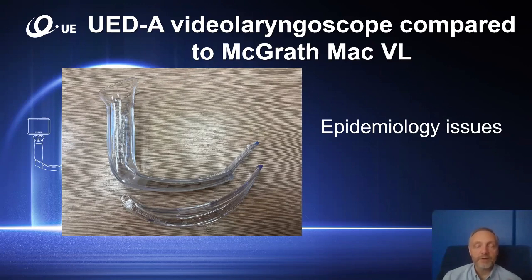And if the cover is only for the blade, there can be some risk of possible cross-infection. If you have the single-use blade together with the cover for the handle, it increases the patient's safety regarding prevention of possible crossover infection.